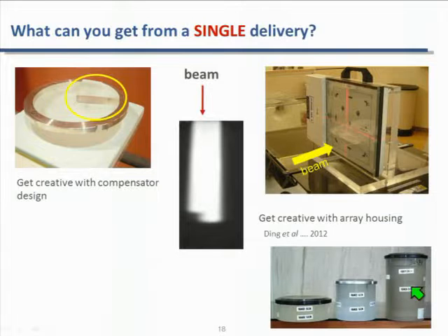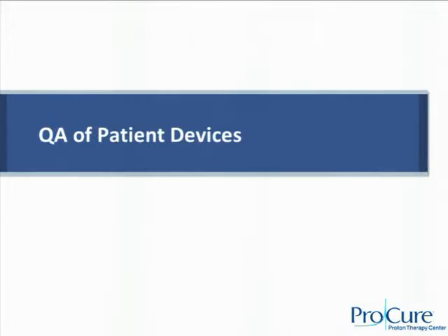Or you can also design multiple, slightly different thicknesses of lucite in different rooms, and that's what we have in our facility, and each room will check a different range of modulation every day.